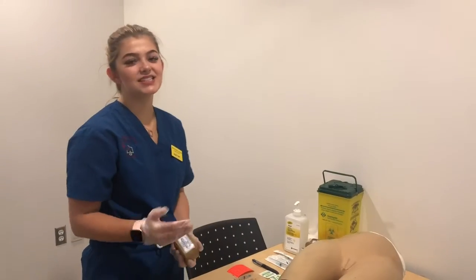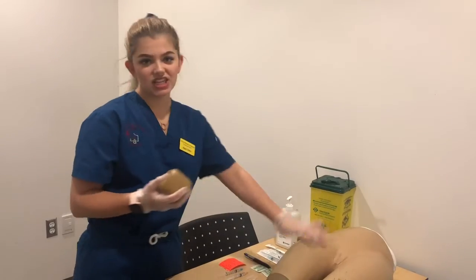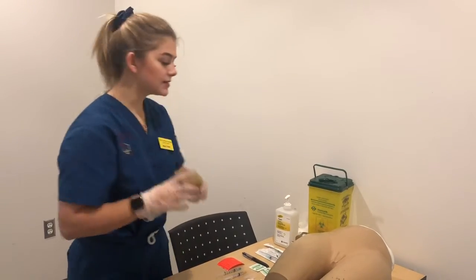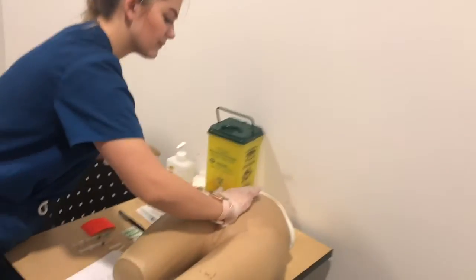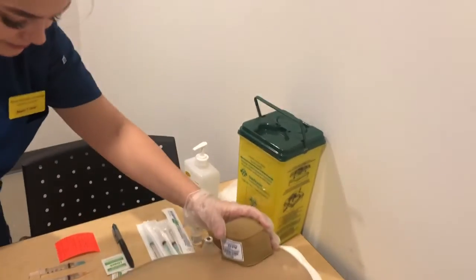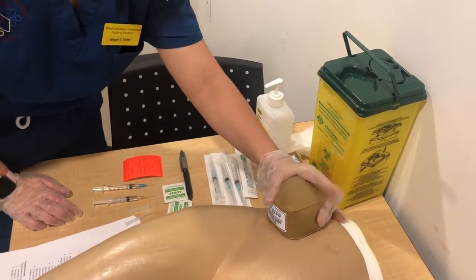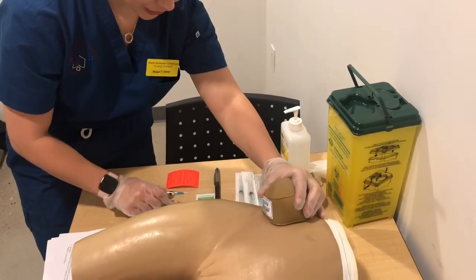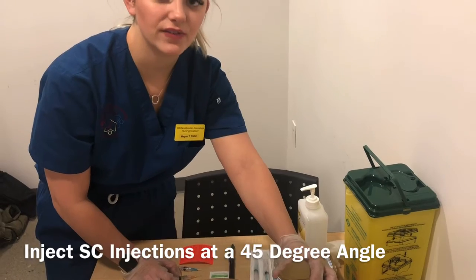Okay, so now that I've identified the area that I'm going to be injecting, I can't inject into the mannequin, unfortunately, so I'm going to use this. I'm going to landmark 2 inches away from the umbilicus. Just going to set my pad here. Since it's heparin, you want to ensure that you squeeze the skin. And when you're giving this subcutaneous injection, you do want to make sure that you're inserting the needle at a 45-degree angle.